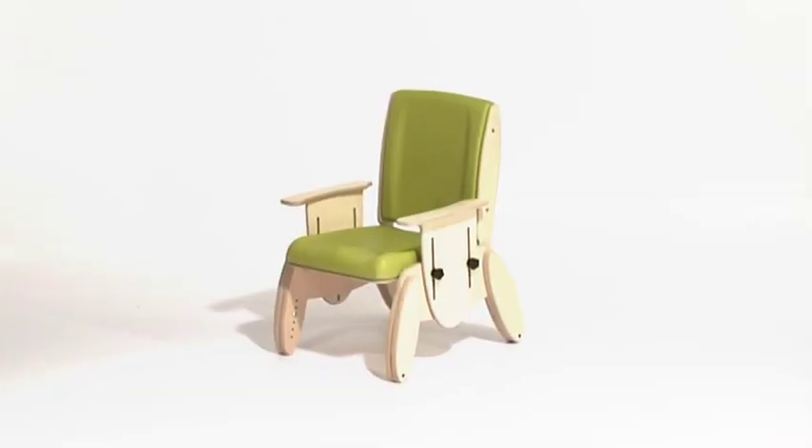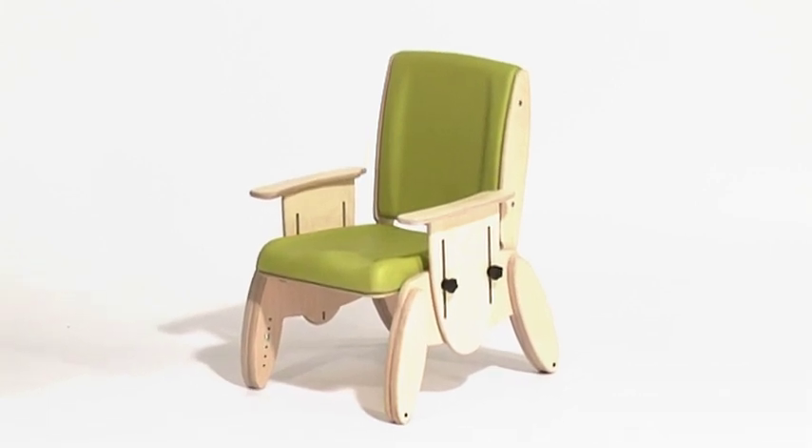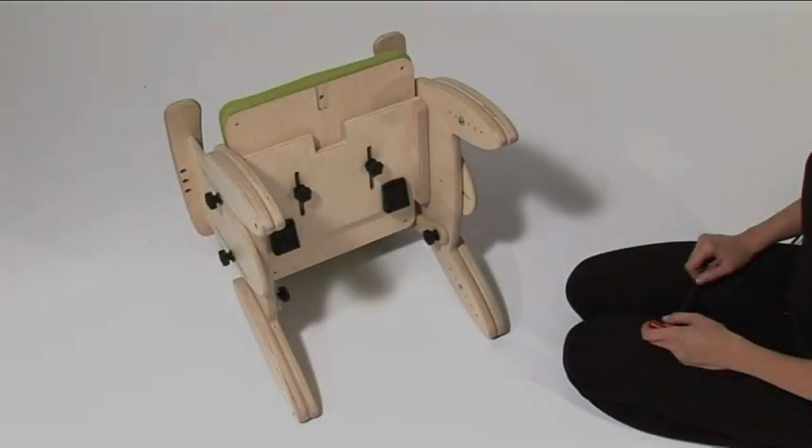Junie's seat and backrest both provide unique contouring. This promotes better posture, gives a higher level of comfort, and helps your child feel more secure and stable in the Junie chair.